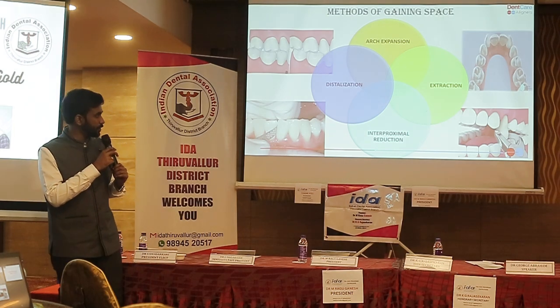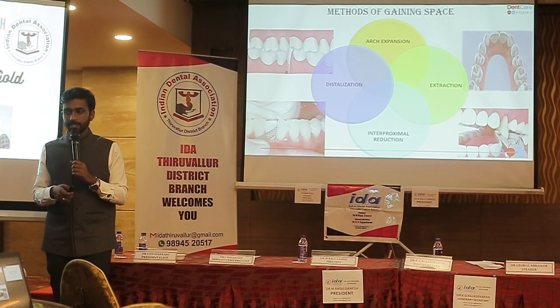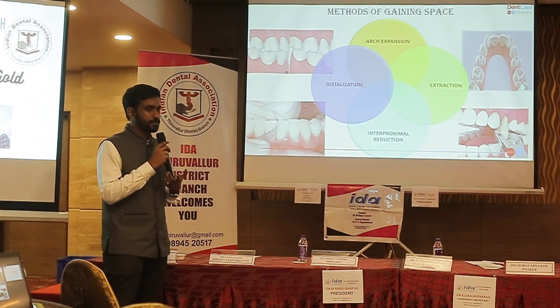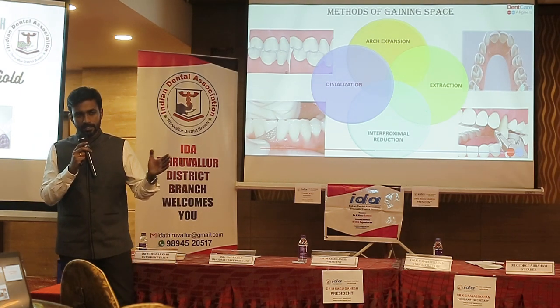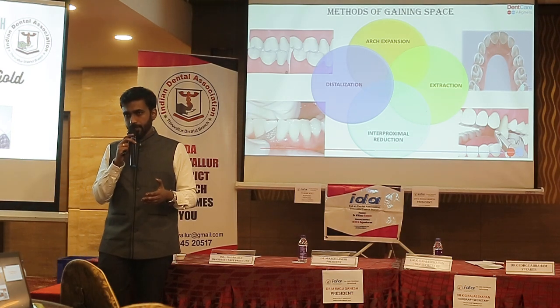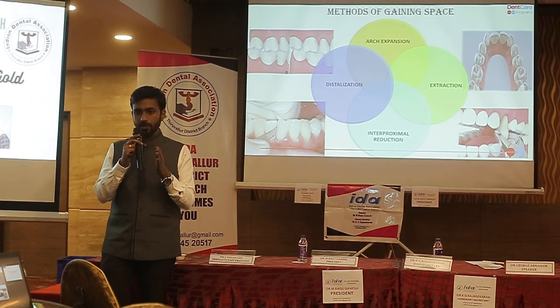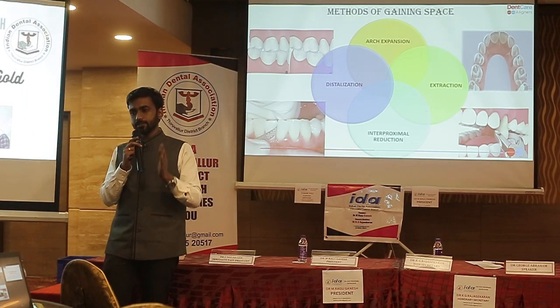required. In such cases, we can go for IPR, interproximal reduction, or proximal stripping, like we call. And since it's a clinical step, this we have to perform in our clinic. I will discuss IPR a bit in detail, because we see a lot of cases where the IPR is done and that is not so properly done. That will determine the success of the treatment.